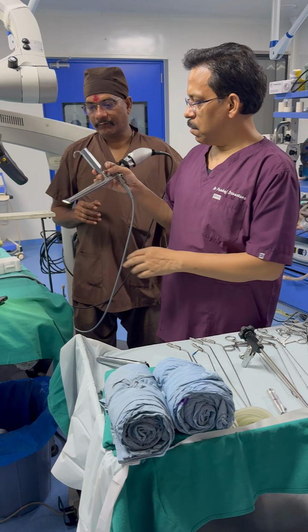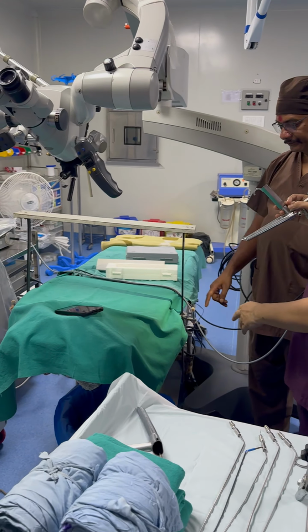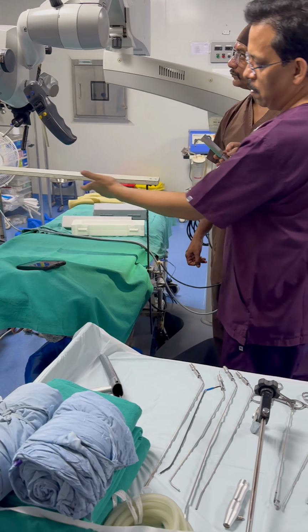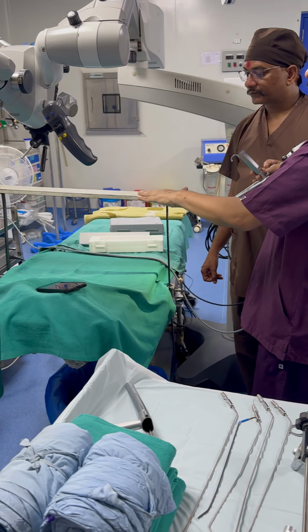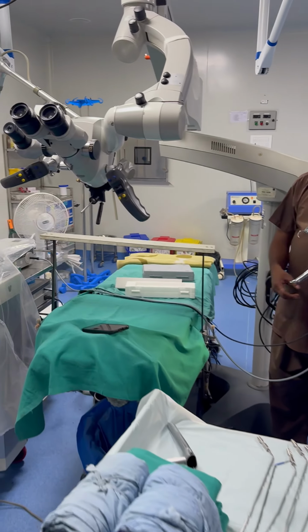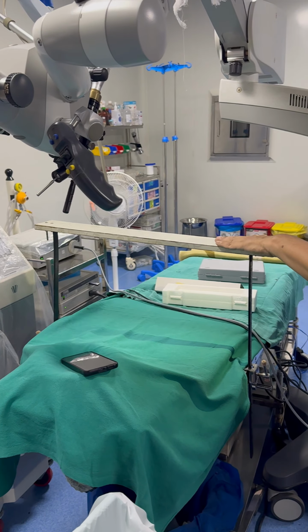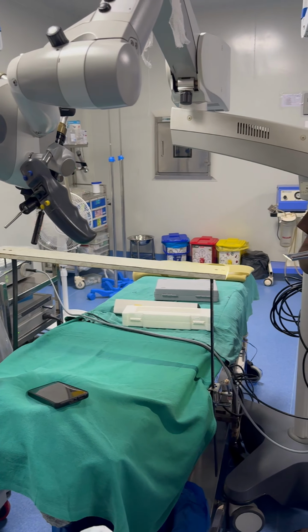Now this is the chest support which we have made ourselves. So this is a steel assembly, and this is a platform. The ready-made one available in surgical shops does not have this platform, so there is sometimes a problem.